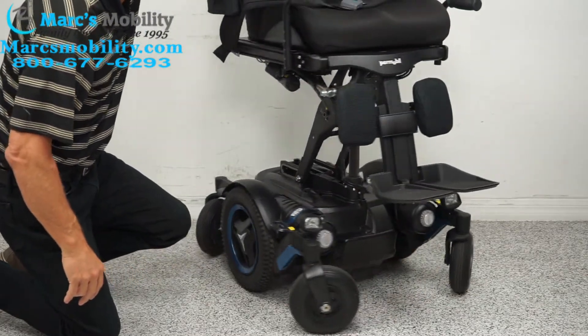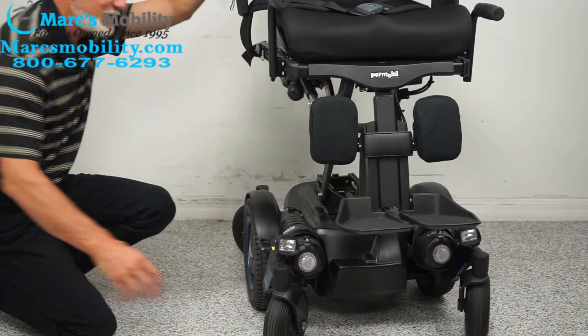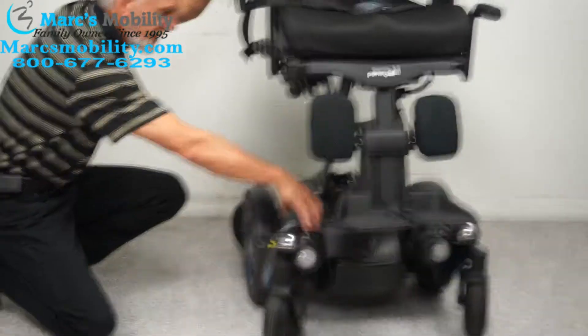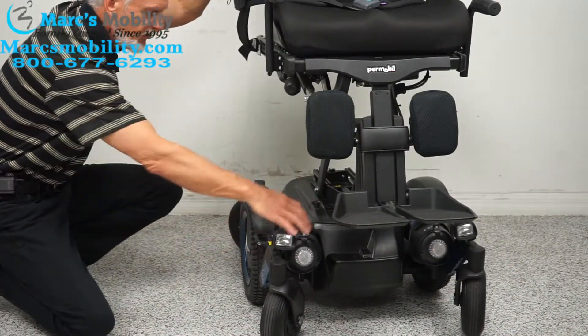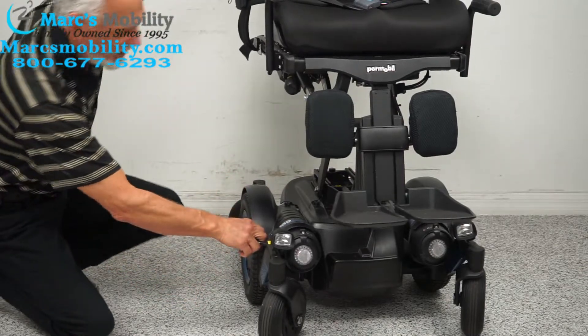The motors are right here, folks. These are the drive motors — they go all the way up to the wheel, direct drive motors right to the wheel. If I want to push this chair, well, it's in gear so I won't be able to, and I'm not going to lift it — it's 450 pounds.